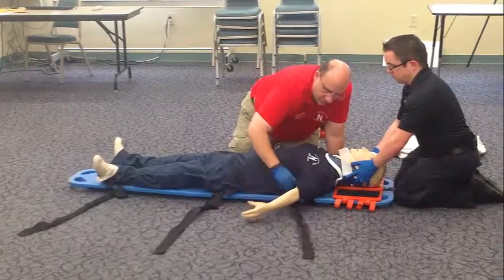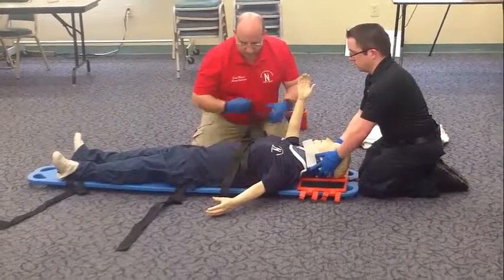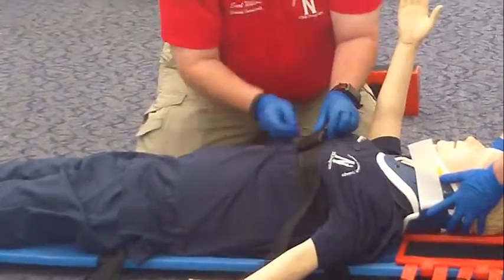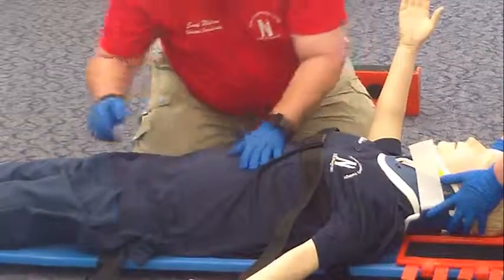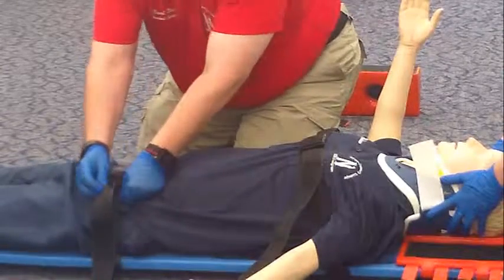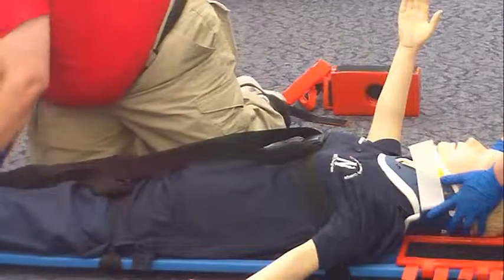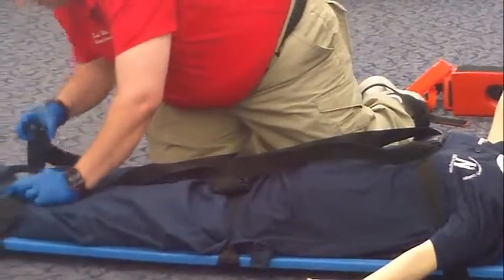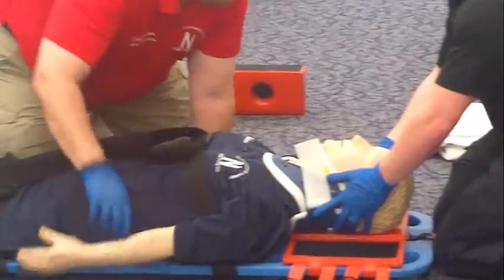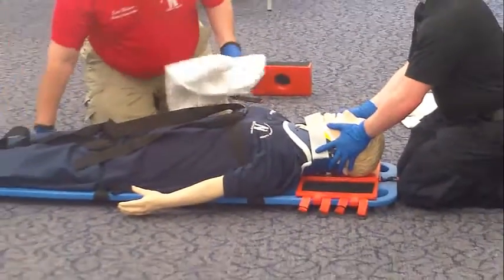I will now secure the patient to the spine board using the straps, starting with the chest. I will take any padding and pad any voids that I might discover between the patient's back or under the knees. I do not see any.